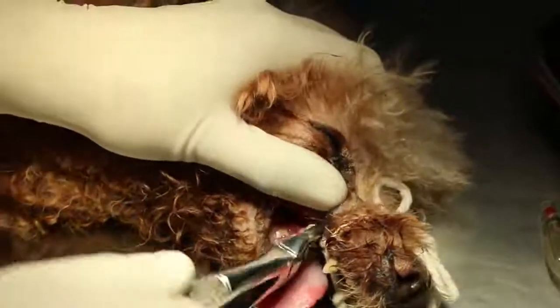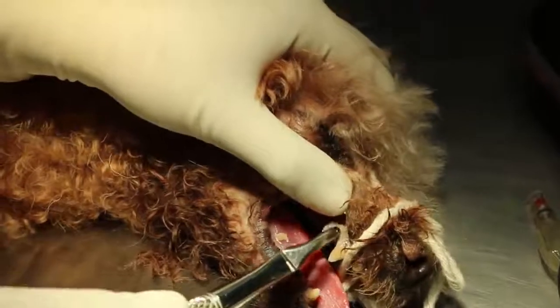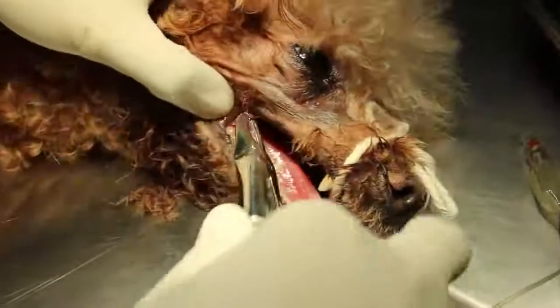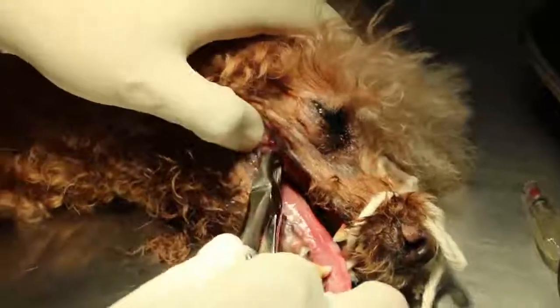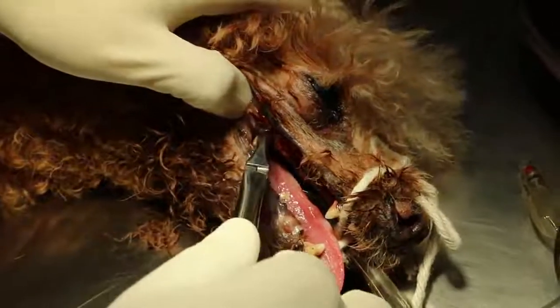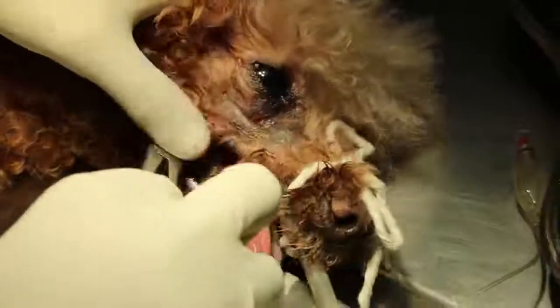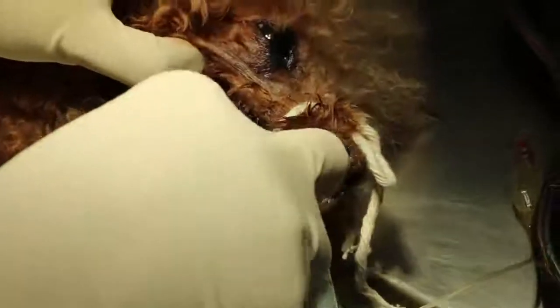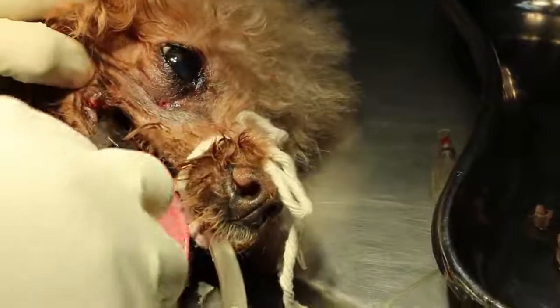Then this one is PM2. All these are right upper. PM1. Then we go up further — any more M1 behind? No more. Check carefully, no more. The M2 — there's an M2, so it's just an extra M2. Write down M2. So we do one by one.